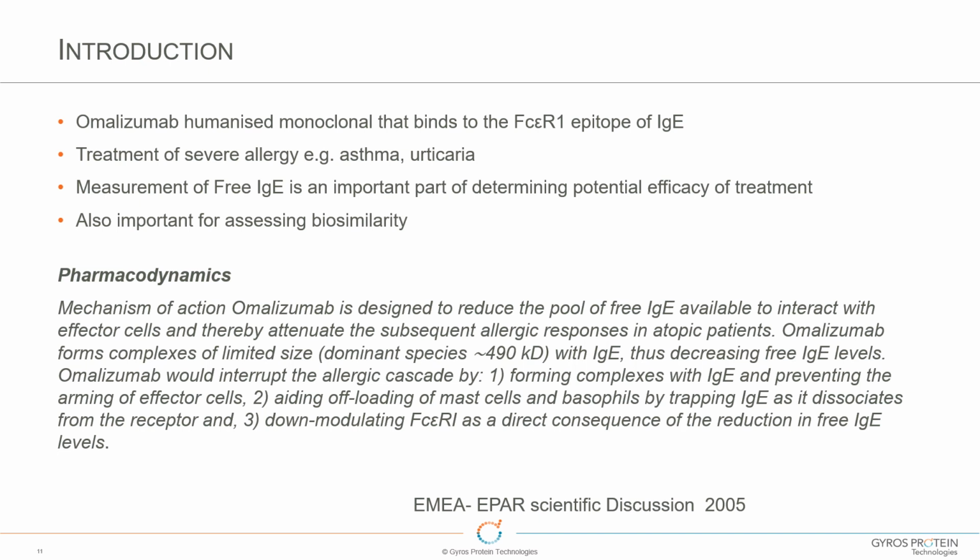So it binds to IgE and prevents the IgE interacting with mast cells and other immune cells, and thereby prevents hypersensitivity. So one thing is that free IgE is actually an important part of determining the efficacy of the treatment. So it's an important part of the pharmacodynamics.